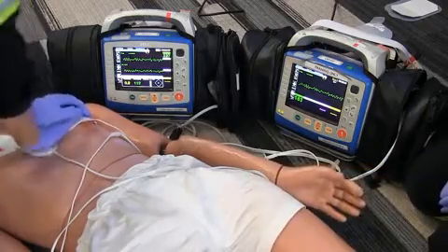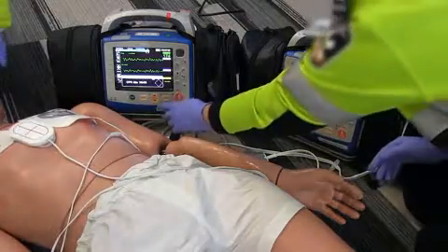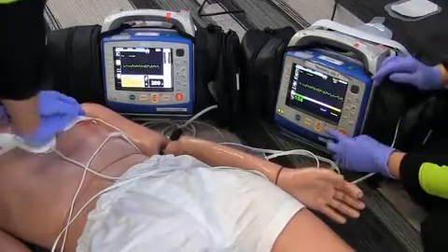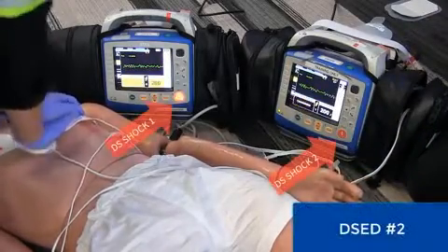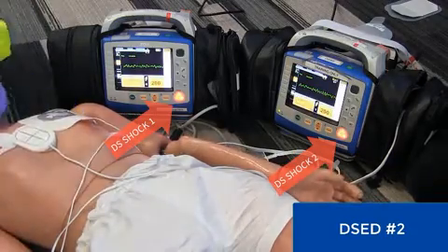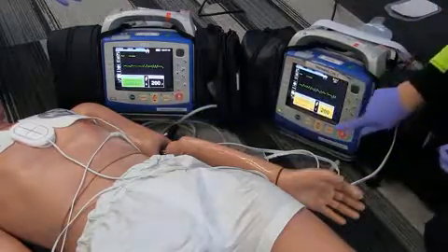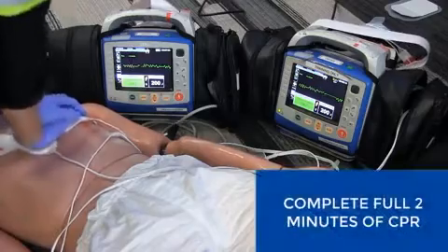Okay, stop CPR. Let's analyze the rhythm. Patient is still in VF. Continue CPR. Charge both monitors for the second double sequential shock. Okay, everybody hands off. I'm clear. You're clear. Everybody's clear. Shock one. Shock two. Continue CPR. Complete the full two-minute CPR cycle.